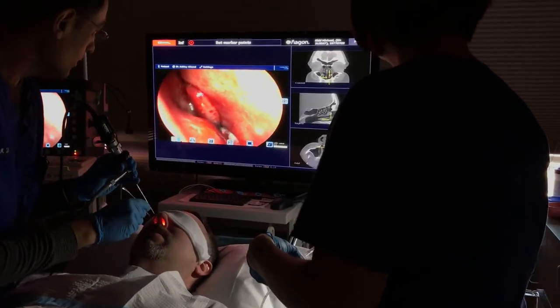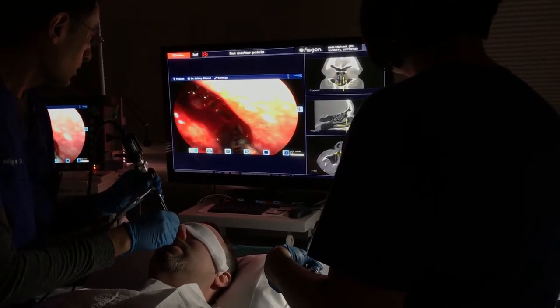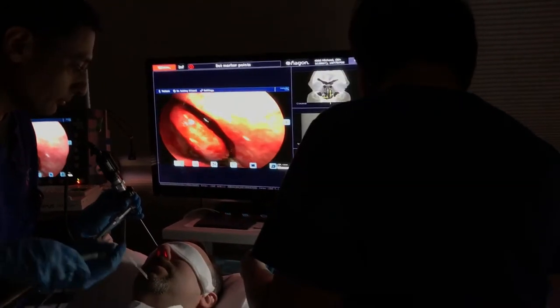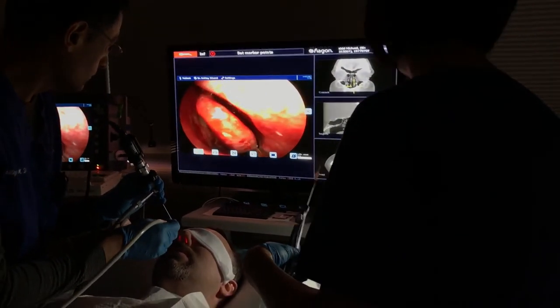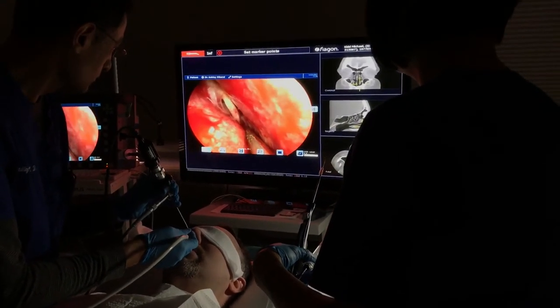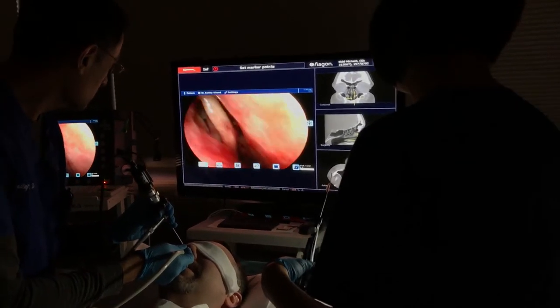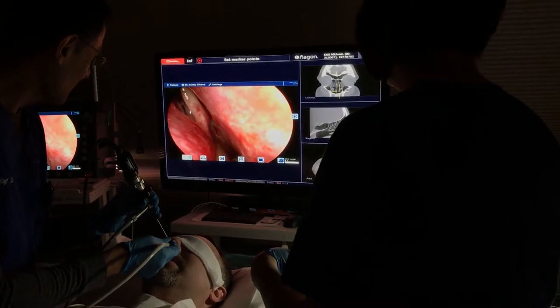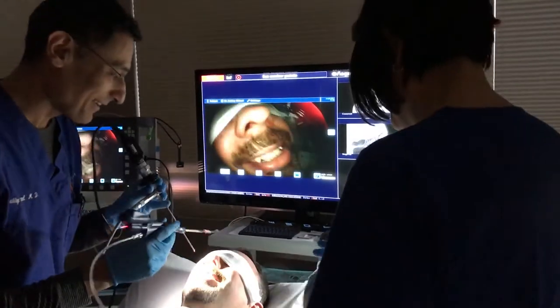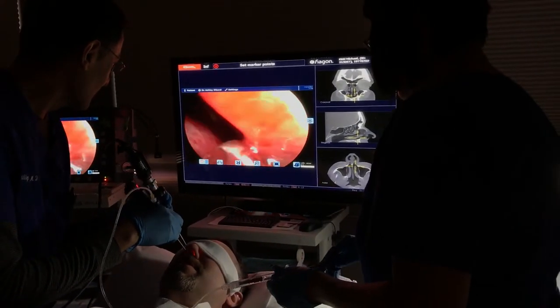And the white at the bottom is the gauze, correct? Oh yeah, that's the gauze. Let me have the suction. Looks like chicken gizzard, honey. Yeah, as long as it's not gray matter coming out, I think we're good. You don't think you have some to spare? I'm sure I've got plenty to spare — it's just a matter of finding that segment versus something that's important.